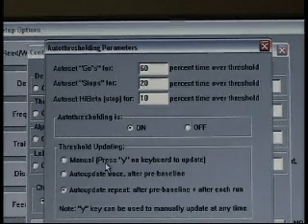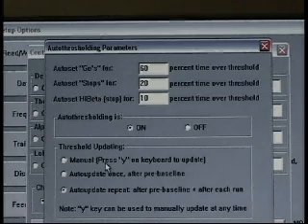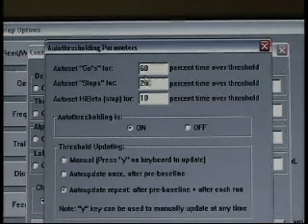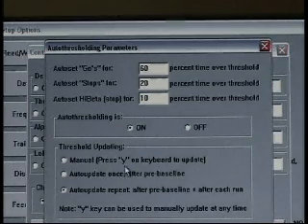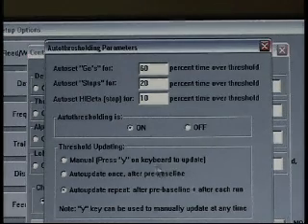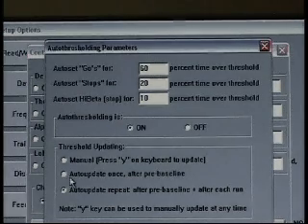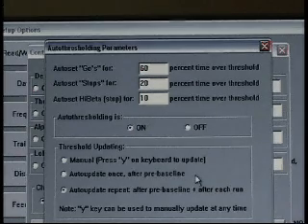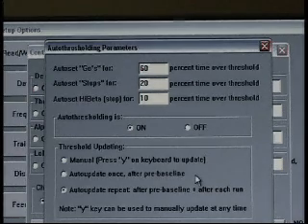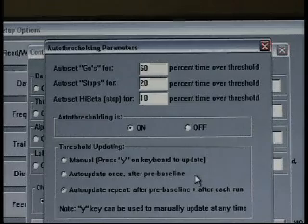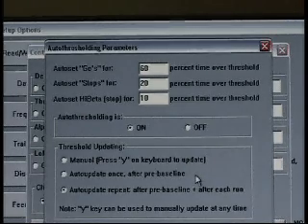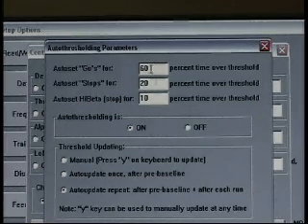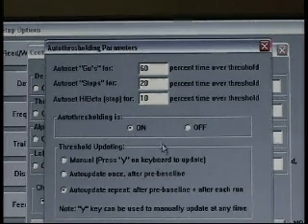Our first choice is manual, that we as a clinician will control when the computer resets the thresholds based on these targets by simply pressing the Y key on the keyboard. Another option is to auto update once after pre-baseline. You may run a 30 second or one minute baseline prior to starting the session, in which the computer will assess the client in a non-feedback based state, set the thresholds then based on these target percentages, and then they'll train on that one threshold for the rest of the session.